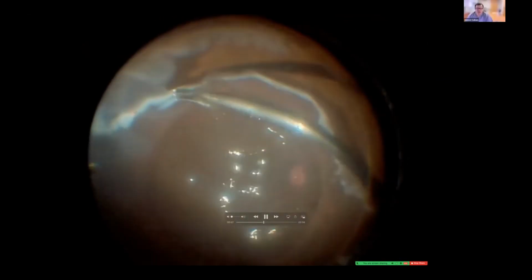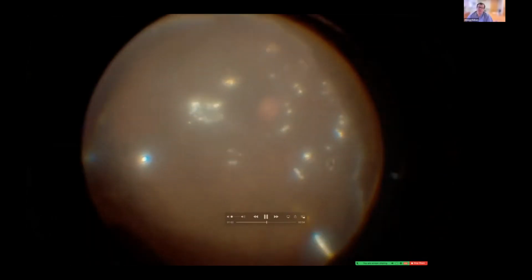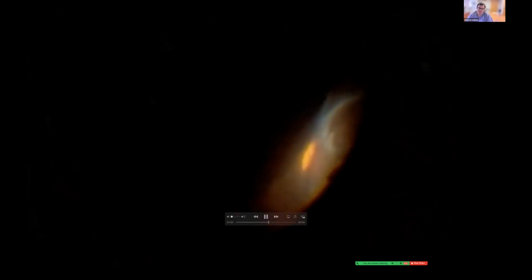And we use the shaved mode of the cutter, which is really nice. It acts like a scissor. And then after that, we go for the cutting mode and remove the anterior flap and then laser. And very important, especially for the young people seeing us, is to understand what happens at the horns of a retinectomy or a giant retinal break. So the PFCL may not reach well, so you may not be able to laser well.